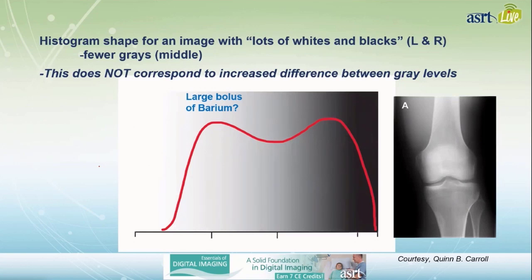Now here's a kind of hypothetical histogram, and I love using this white to black background on these histograms. I think it really helps your students to understand what you're talking about. So pay attention to that as we go along.